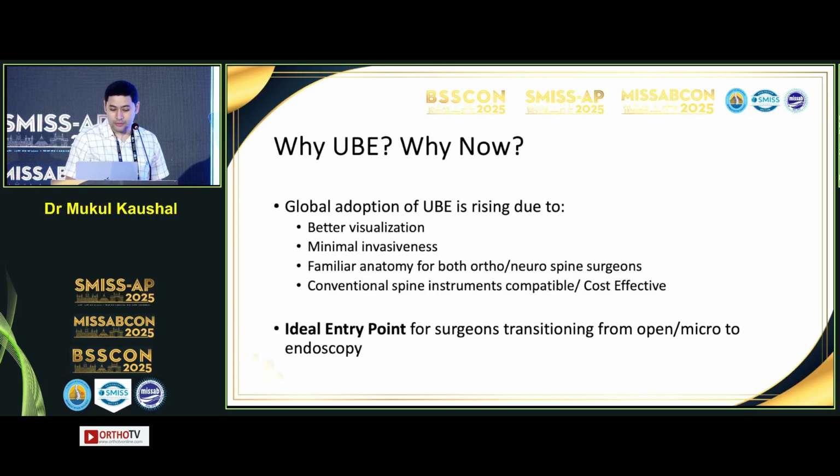There's minimal invasiveness. We are quite familiar with this anatomy, either via an open approach or via a microscopic approach. And the best thing, it is very cost effective. We can use the same set of instruments which we are using for our conventional spine surgeries. And for anybody who is already practicing open or microsurgeries, this is the ideal point to transition to the endoscopic world.